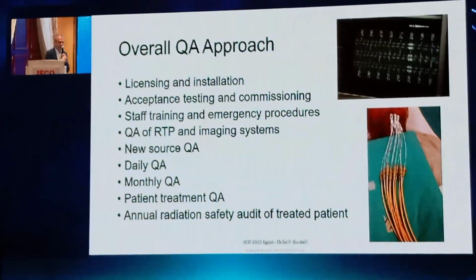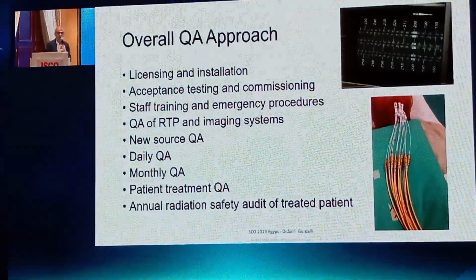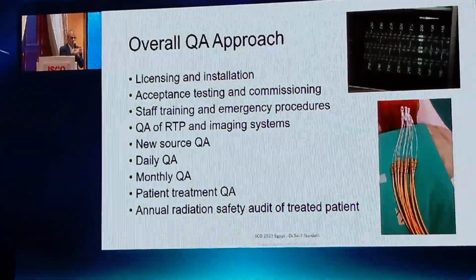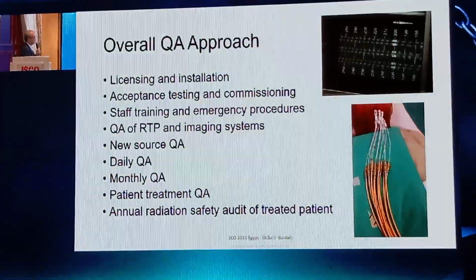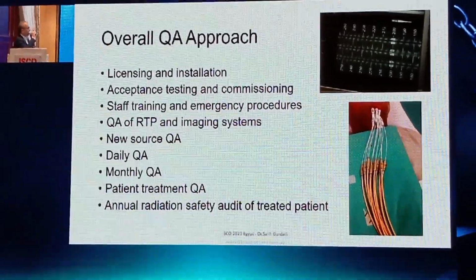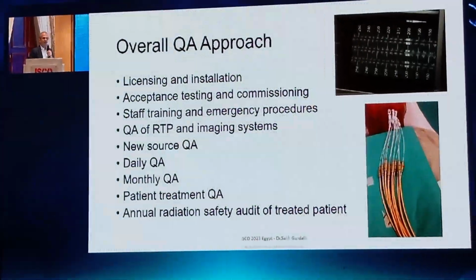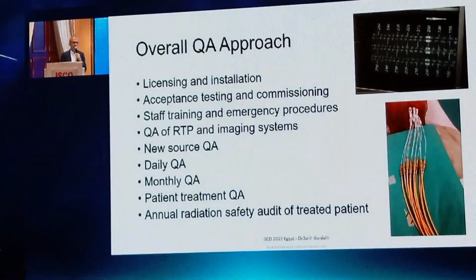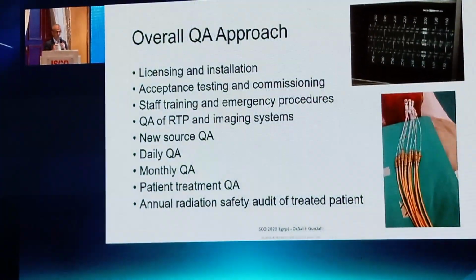Okay, Sally checked it, and then, hey, Paul, would you please check again? Oh, Sally, you did it wrong. It happened to me a couple of times. So minimum, two people have to check those connector cables and the catheters. And also one of the big things, don't forget to check your source position every day. But yesterday was okay, correct? What was wrong today? No earthquake, no fire. It's still summer, no temperature changes. Again, policemen and thief. You never know.